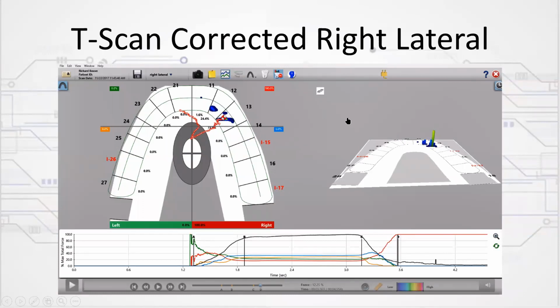And again, it took one appointment to straighten it out. And he had many appointments where it didn't get straightened out. And so this is the nature of these problems. They don't go away just because the patient comes back and we remark the teeth and try to adjust. We need some way to know that we've improved it. And T-scan is a great diagnostic tool, a great treatment tool, and a great metric to follow up and determine that you got the right result.